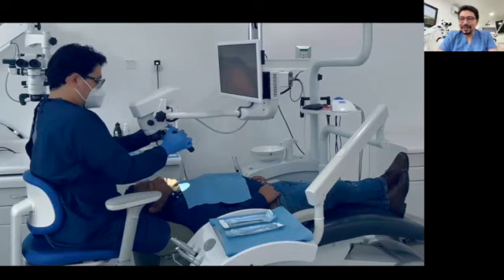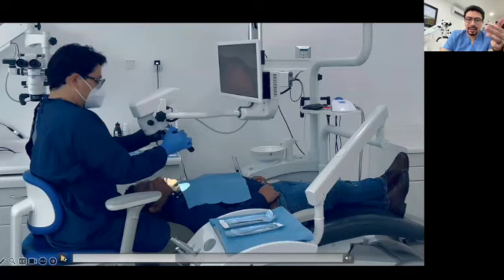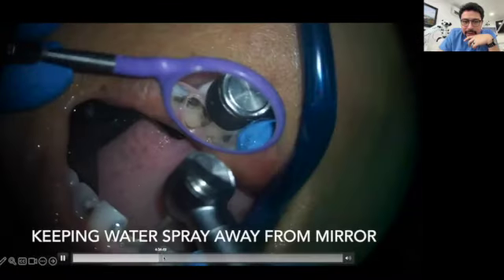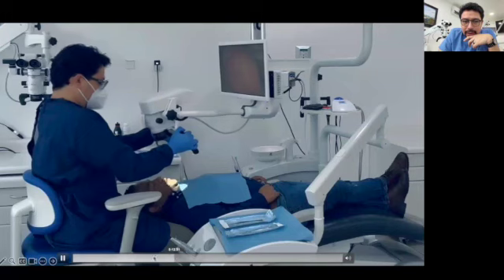That is the position that you need on the patient. They need to take down the chin, and the position of the head of the microscope when you want to have a direct vision in a lower molar. It's comfortable, but sometimes it's needed to use the mirror as well, depending on what you are doing and what you want to see inside of the tooth, often for checking the progress of the preparation.